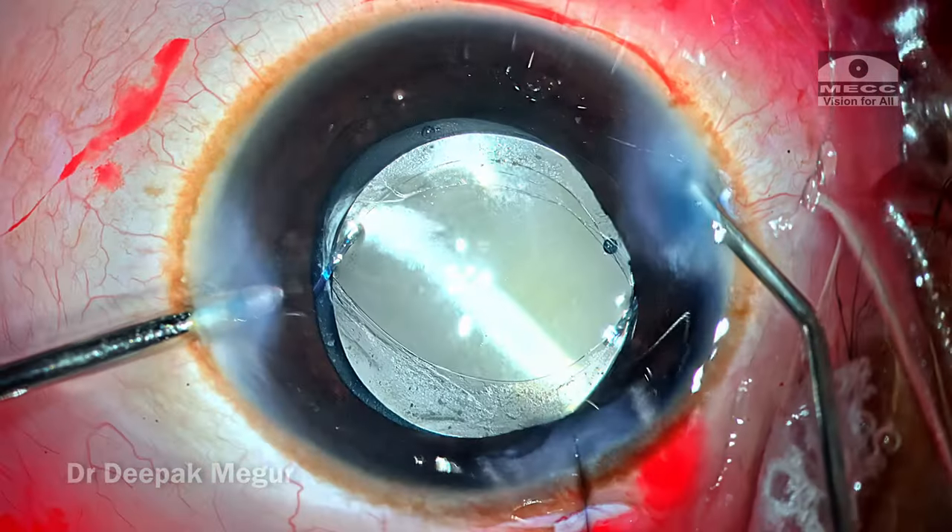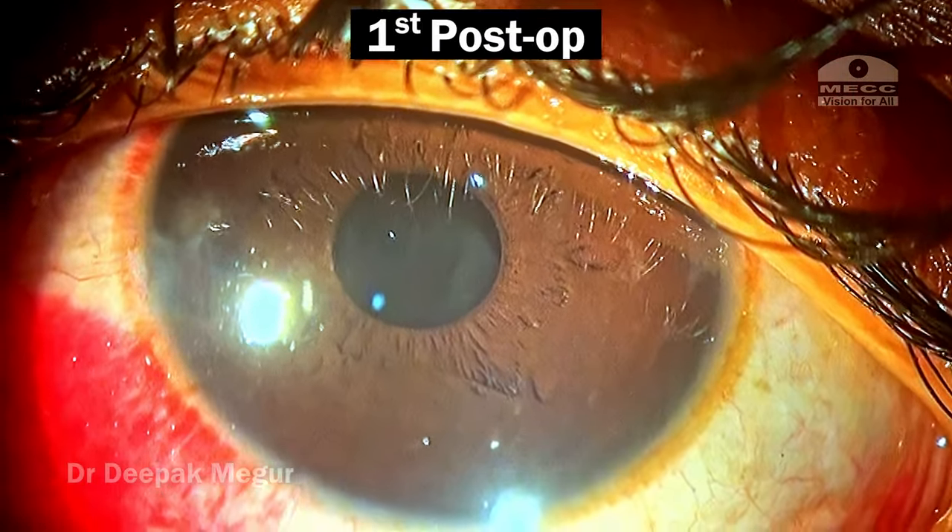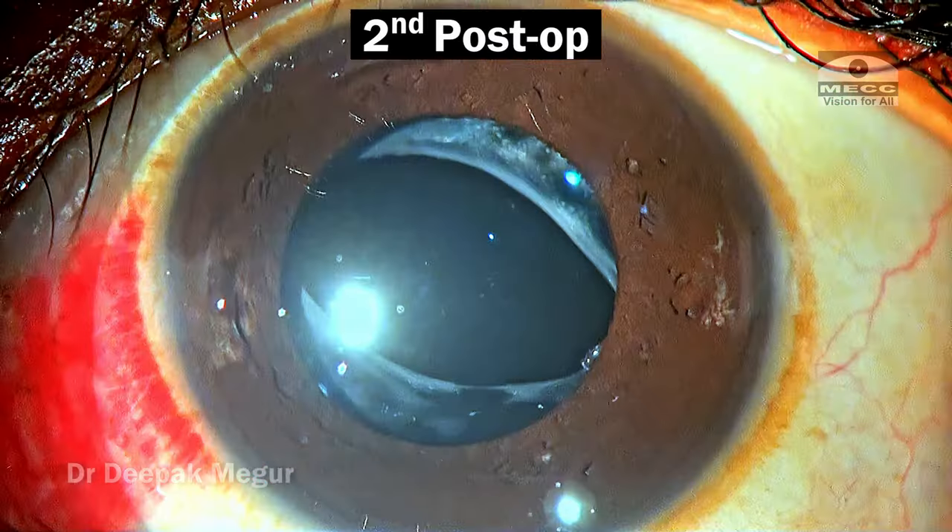The side ports are hydrated, intracameral antibiotics are instilled, and the case is done. These are the first-day post-op pictures, and the patient continues to do well.